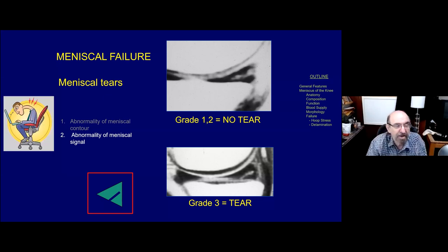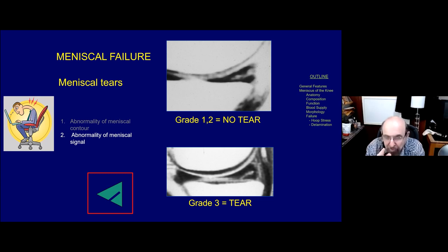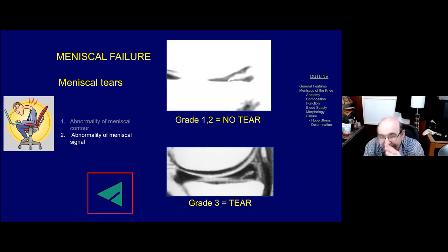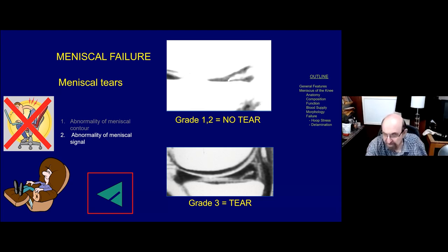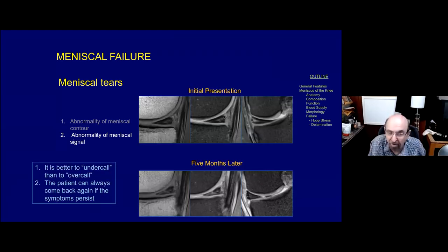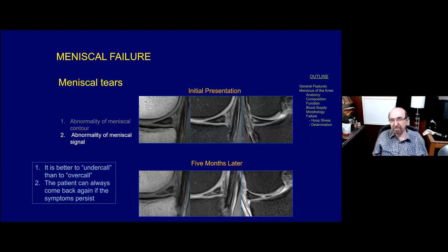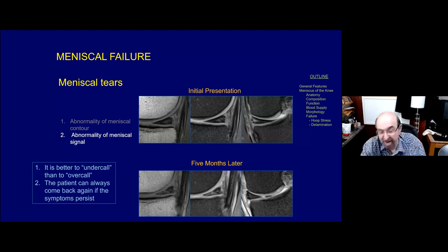What I've found through the years is that the resident or fellow gets up very close to the computer screen trying to make that last pixel bright to change a Grade 2 to a Grade 3, even using meniscal windowing. You should be able to sit comfortably in your chair and this should be obvious at a distance. It's my view that if you're not sure, it is better to undercall than to overcall a meniscal tear. In some cases, signal that initially was inside the meniscus may later - five months later - become obvious Grade 3 signal or a tear. But the patient can come back for a second scan if pain is persistent.